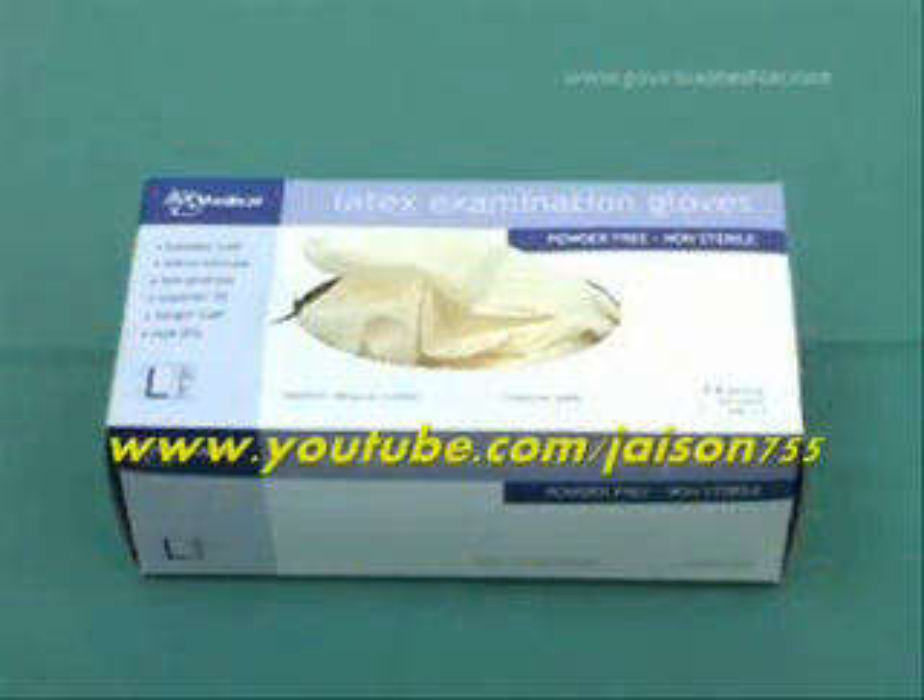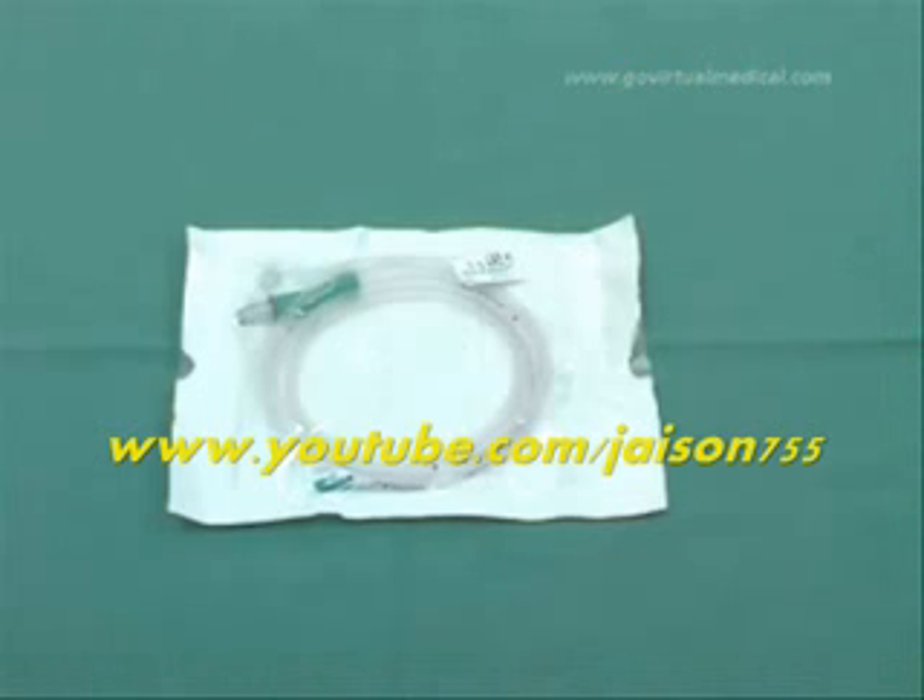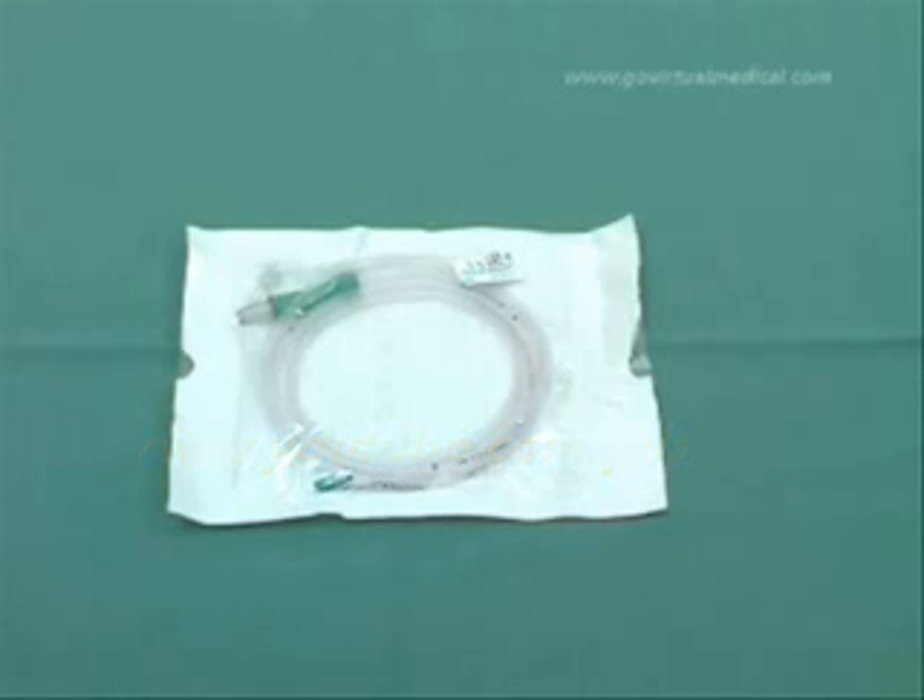Non-sterile gloves and a nasogastric tube — these come in various sizes. Generally, the fine bore tubes are used for feeding and the large bore tubes for drainage of gastric contents.